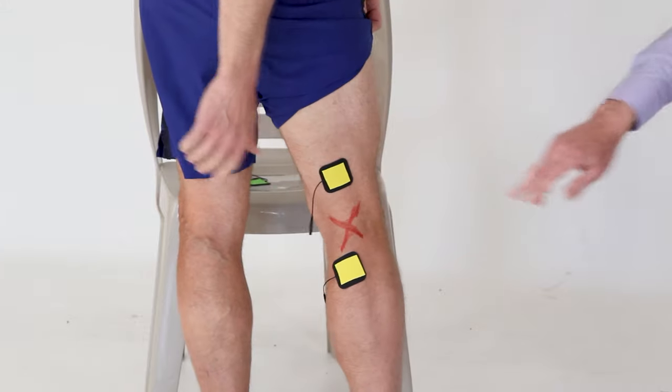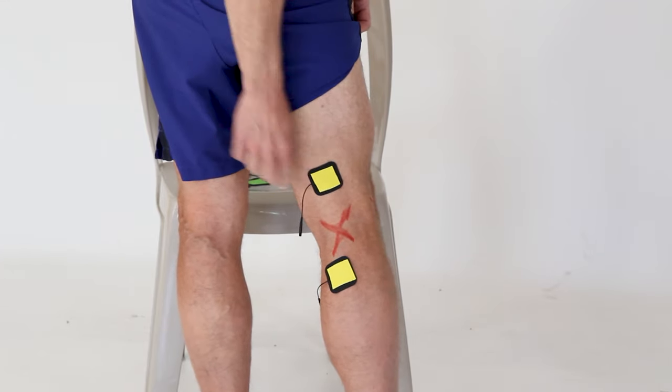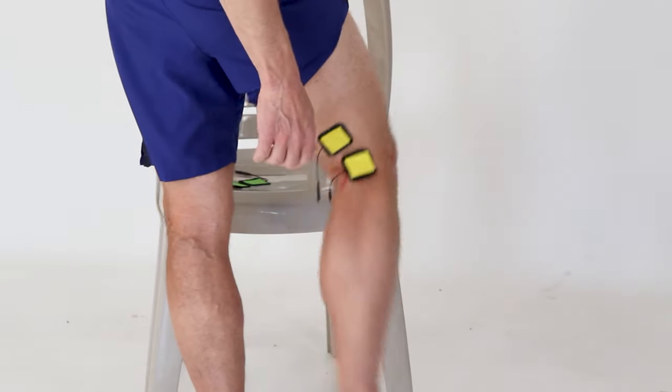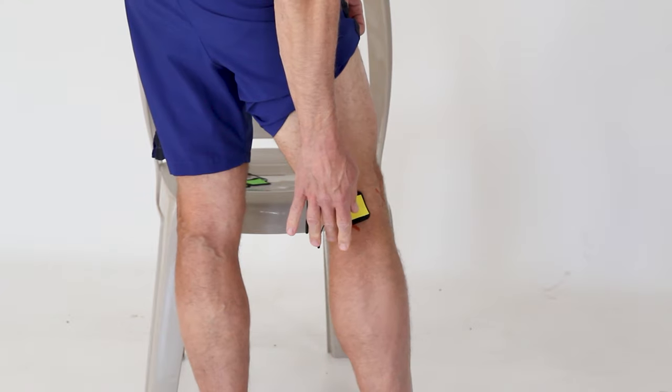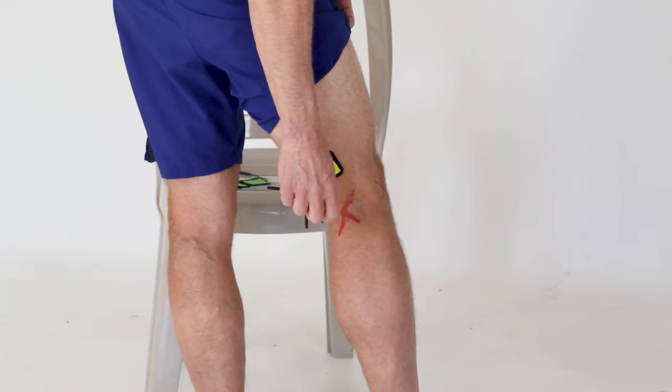So he's got one above and one below. That's probably the only choice you really have in the back, don't you, Brad? Yeah, because you don't want to put one on there. If we do that, it's just not going to work out at all. Right, and you really don't want to go side to side. There's really not room.